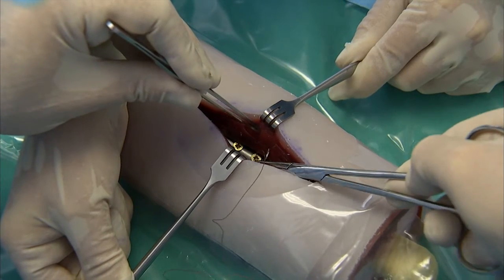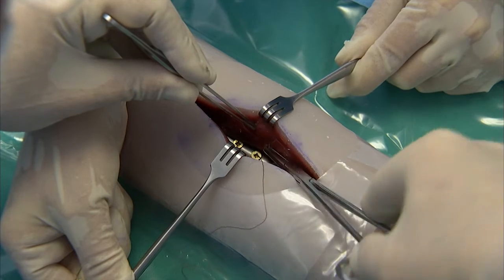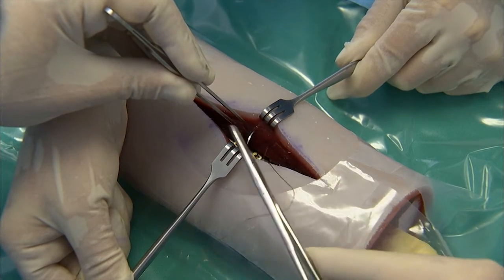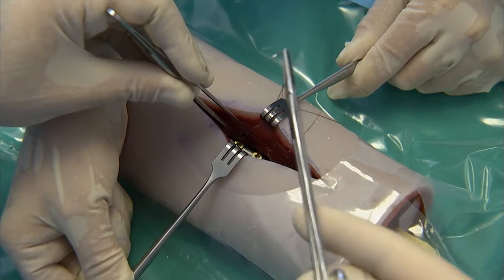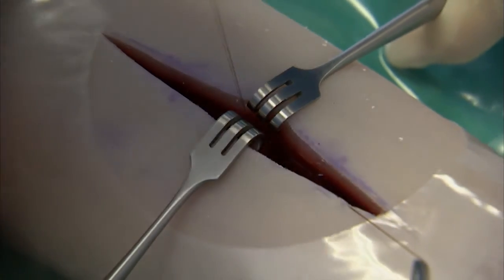The suture needle is clipped onto the needle holder and adjusted with a tissue forceps. The subcutaneous sutures are usually placed with the knots placed in the depth of the tissue, away from the skin side. The assistant retracts to facilitate vision during the suturing procedure.